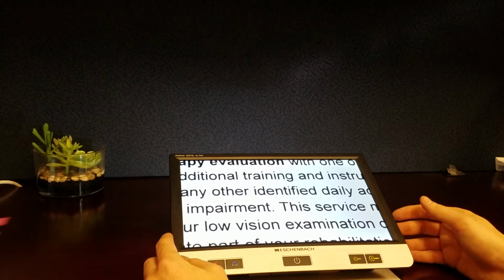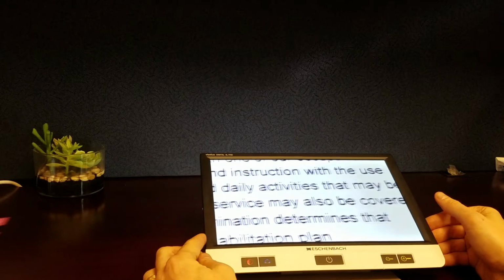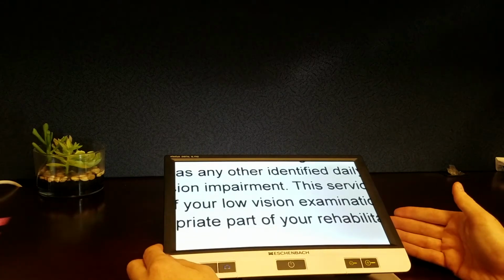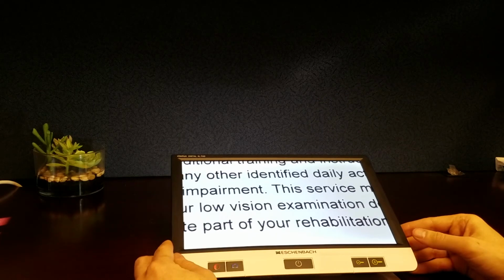This might work particularly well with things like newspapers or magazines where the text is in columns. You might find that you don't actually need to move the device itself at all. You might actually just be able to use those scrolling buttons or the touch screen to scan across the sentences left and right and up and down.